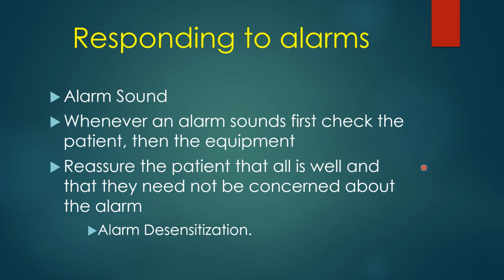You have patients sometimes that set off alarms pretty frequently, coughing, agitated or whatever, or maybe only occasionally an alarm goes off for some reason. And the patient on the ventilator doesn't have much experience with this. He's probably never been on a ventilator before. He knows he's in the intensive care unit. He's critically ill. He's connected to a machine. He knows that's life support, and it's alarming, and nobody seems to be concerned about it. Well, that could be very worrisome for the patient.